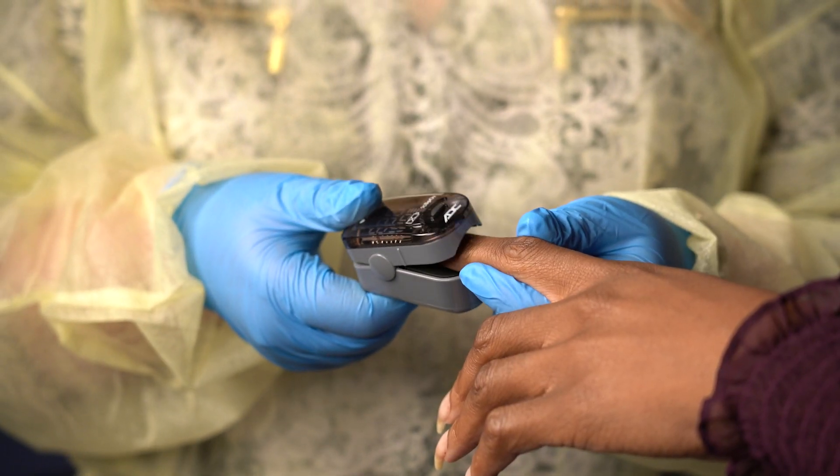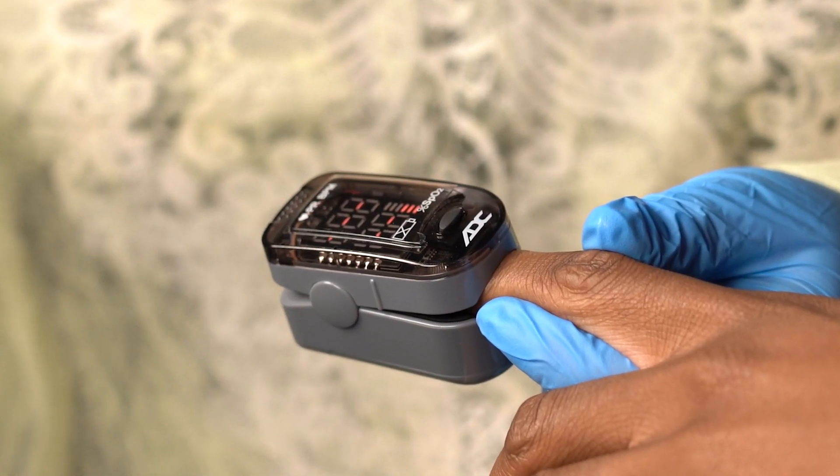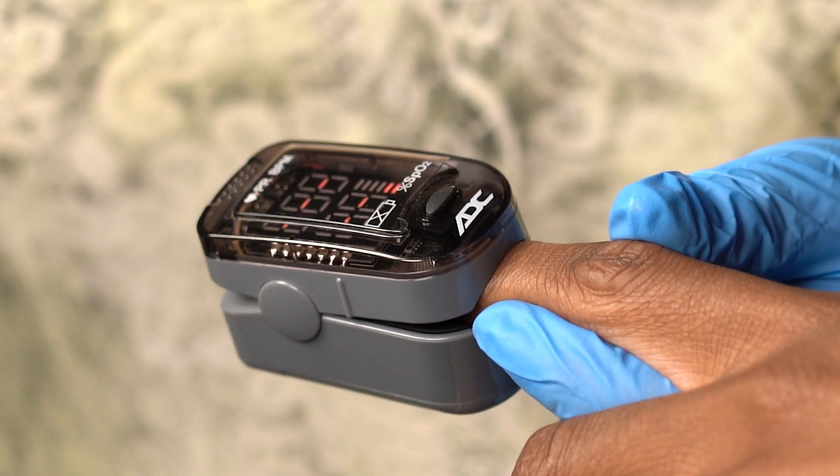Make sure to keep your pulse oximeter charged so it's ready to go. Turn on the pulse oximeter by pressing the power button. Place the pulse oximeter so there's a snug fit on the finger. The probe shouldn't be too tight, which may constrict the blood vessels, or too loose, which may cause it to fall off or let light in.